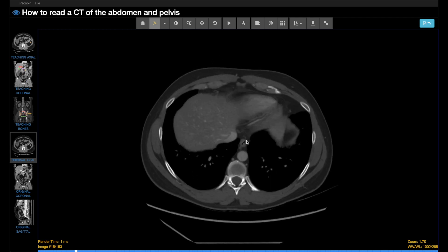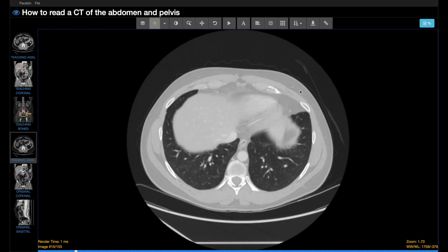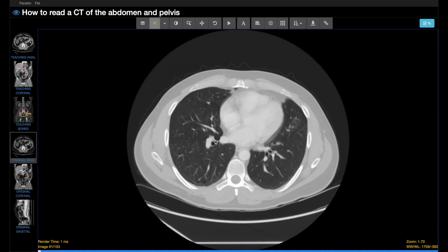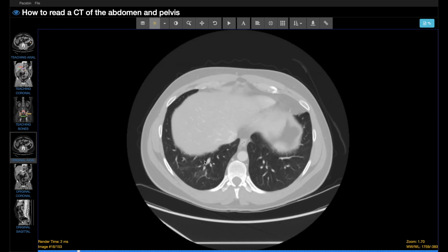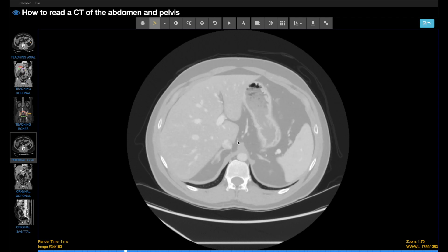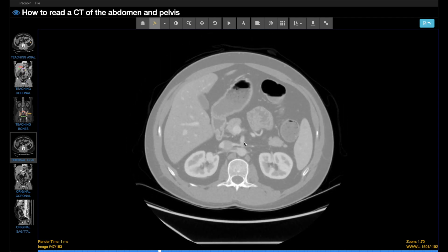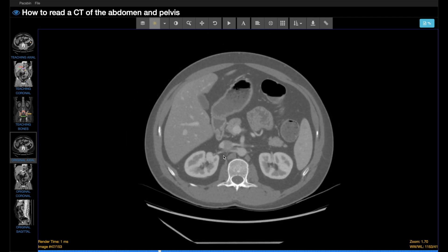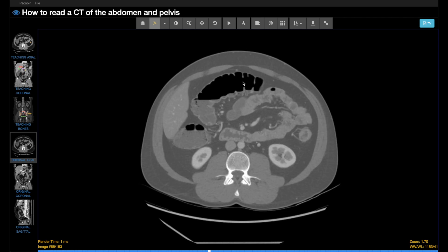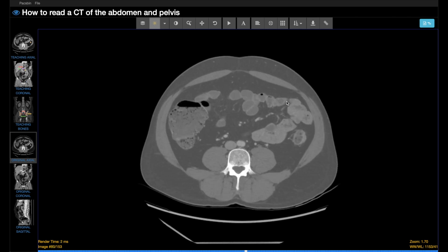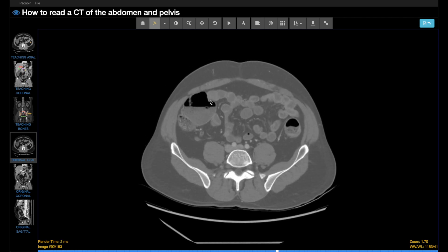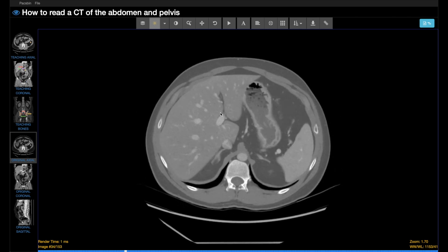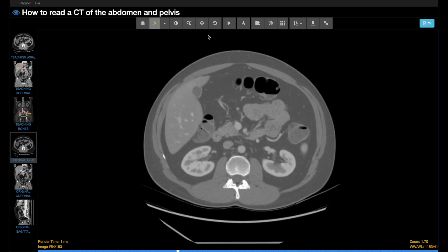When looking at the lung bases, we'll use a lung window, which helps us to see some bibasilar atelectasis. I'll use more of an intermediate window to look for free air, which also allows me to see some of the abdominal organs and bowel at the same time.